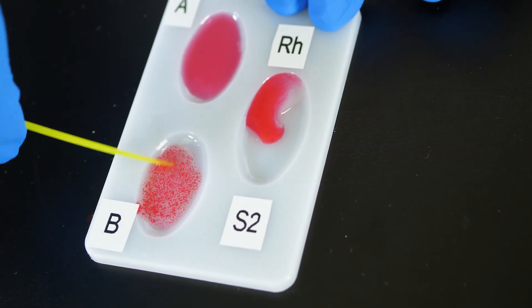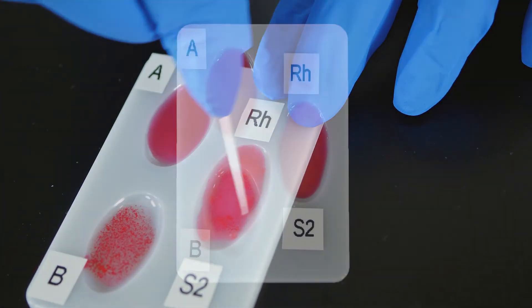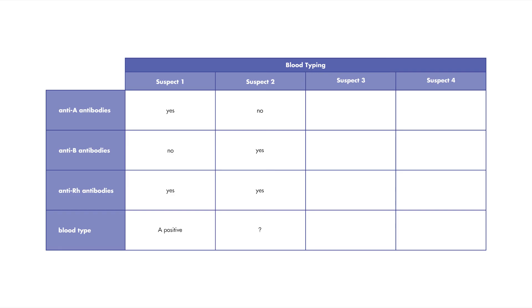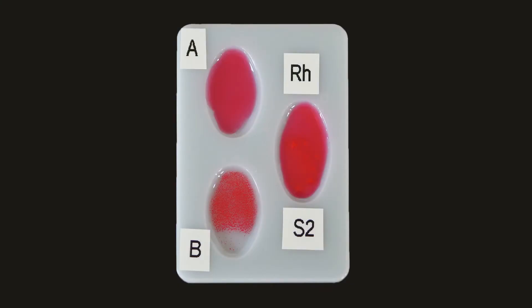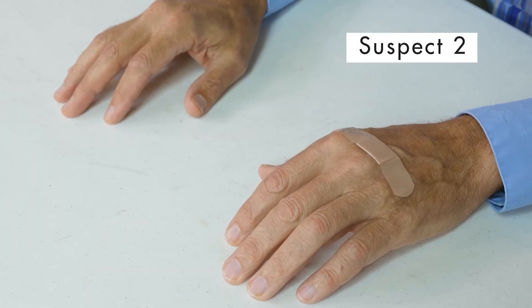Now we follow the same procedure to test the blood of suspect 2. The cells in well A show no reaction, but the cells in well B are sticking together, as are the cells in the Rh well. We conclude that this blood type is B positive. Since the blood of suspect 2 does not match the blood found at the crime scene, suspect 2 is probably not the one who took the sandwich.